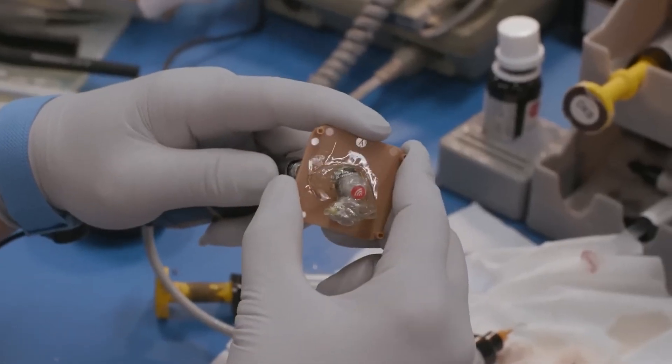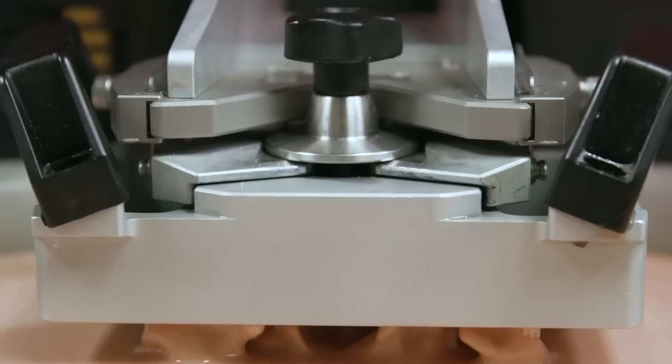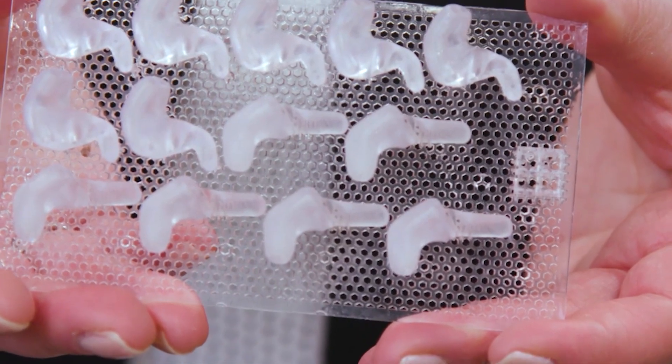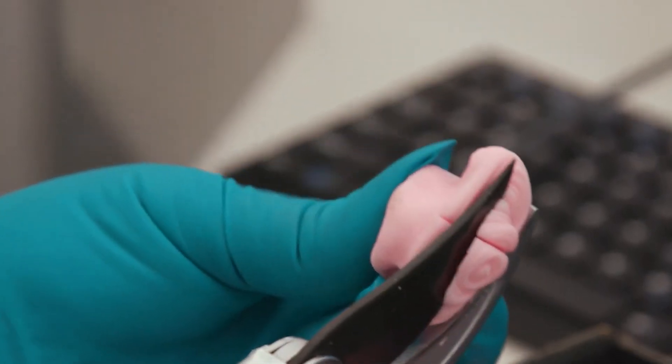Today, the entire process of making an acrylic shell from the silicone impression can be done within minutes via a 3D printing machine. Whether produced via 3D printing or manually, the shell still has to undergo finishing touches before it can house all the hearing aid components.